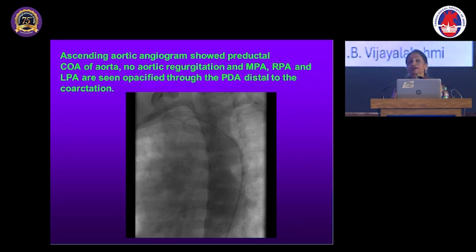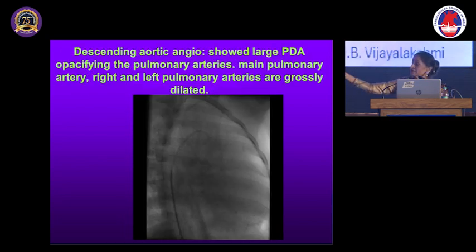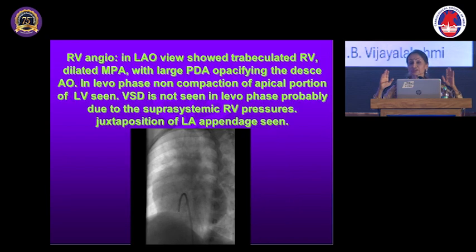So remember, in cardiology, a single diagnosis is not enough. There can be multiple problems, and here the patient had coarctation with the RSOV. So always identify the distal one, tackle it first and then come back. I have stented the coarctation, then came back to the RSOV and closed it with the PDA device. This patient was all the time treated as rheumatic fever, came with atrial fibrillation, pulmonary edema, and was taken on the table for the balloon valvuloplasty.